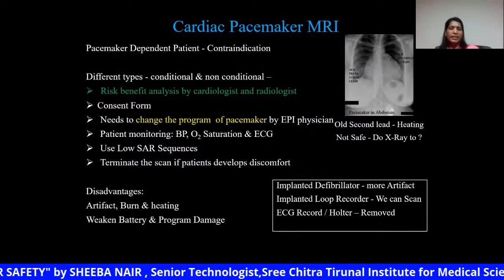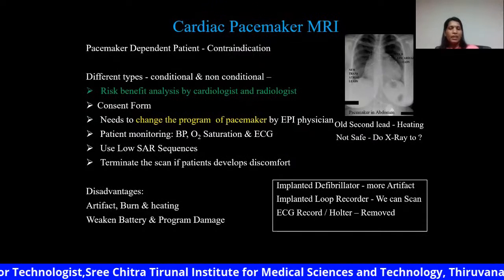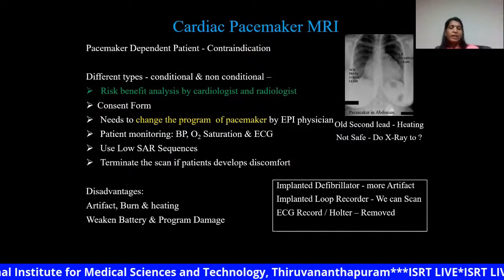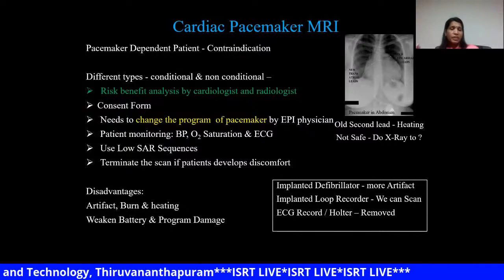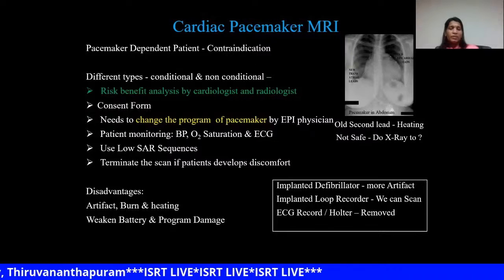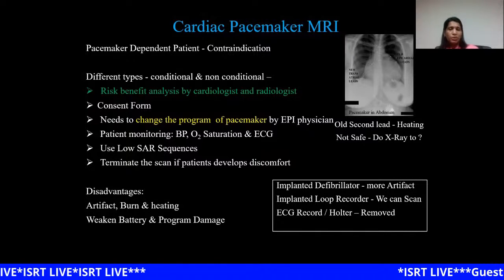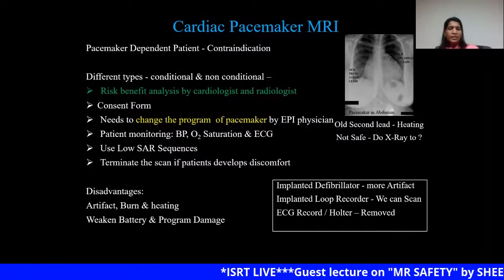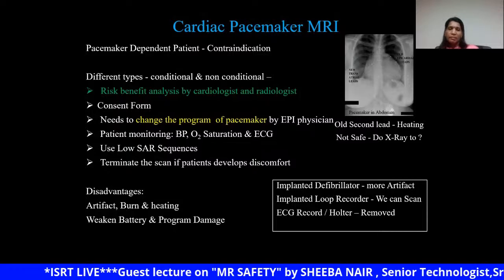The patient's vitals such as BP, oxygen saturation, and ECG have to be monitored, and it will be better if this is done by a cardiologist or the EP physician. And we should always follow the safe conditions. We should use low SAR sequences, and always make visual and verbal contact with the patient.